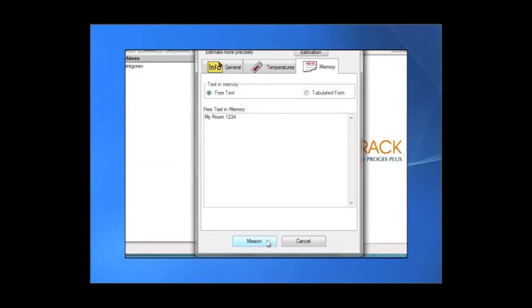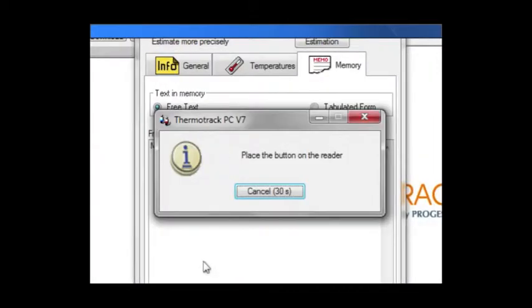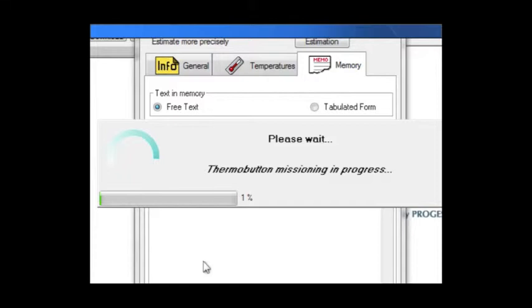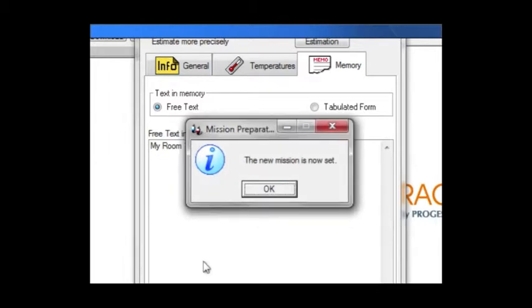Now, all parameters have been settled. You can mission the button. Previous data will be erased and a new mission will begin. We're done!